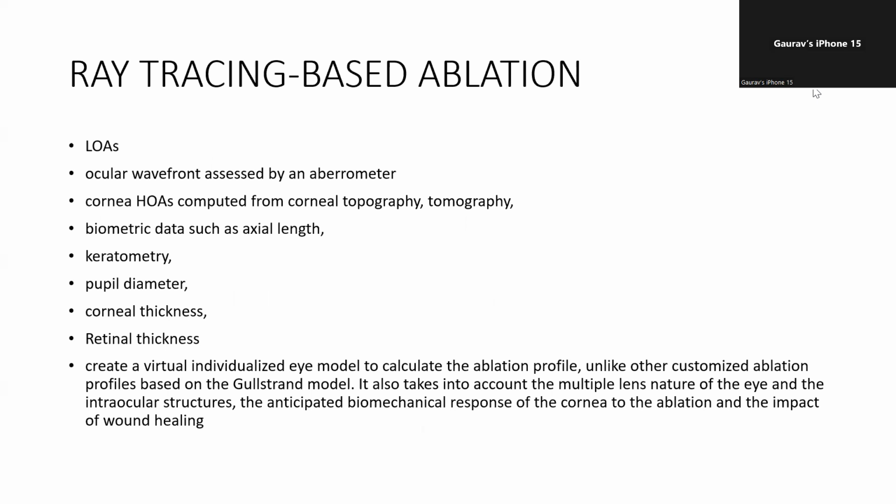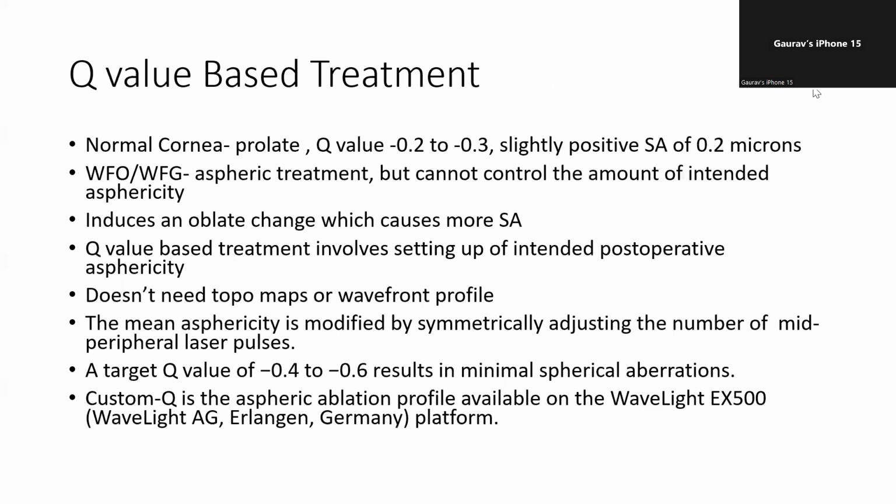If you wanted to do custom Q on our machine, the EX500, which treatment modality would you use? FCAT, sir. Right.